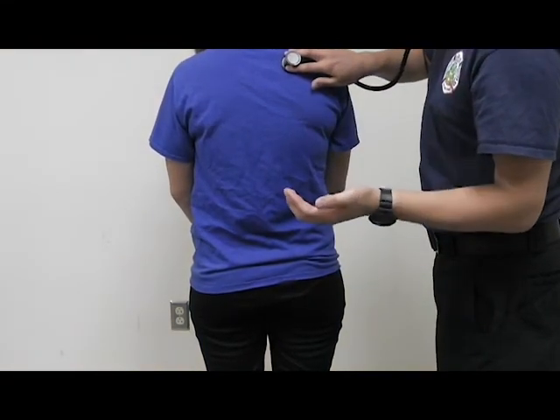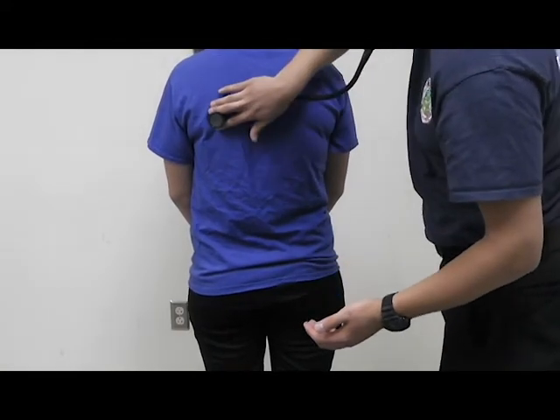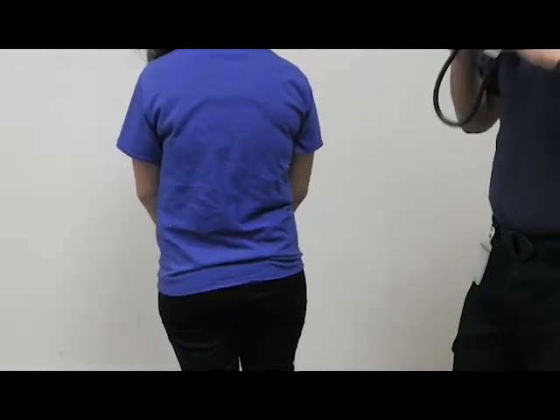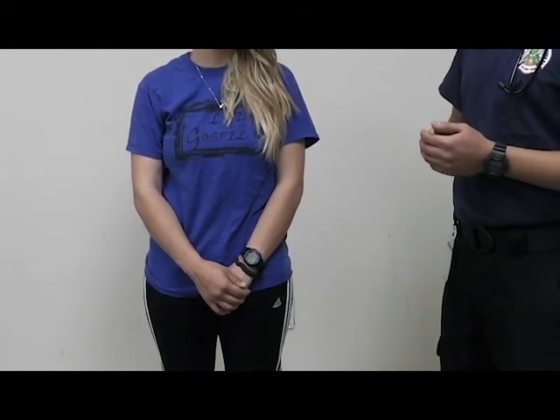For the back, take one up here avoiding the scapula, telling the patient to breathe in and breathe out, then continue over each point. It's important to know that when doing this, you are listening for any respiratory compromise. If you hear any crackles, wheezing, or anything like fluid in the lungs, that would be considered abnormal. Make sure you record those findings, and if necessary, take additional lung sounds to determine if it is upper or lower respiratory.